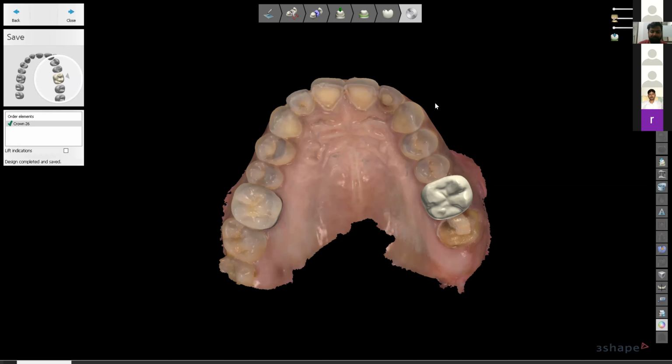I'll check, ma'am. Maybe next time when you are with us, you may show. I'll do that, ma'am. What I'll do is I have a demo case. I'll import the demo case and I'll show you how we design a customized abutment or a screw-retained crown. Yes, definitely.